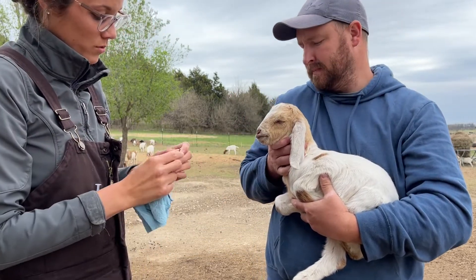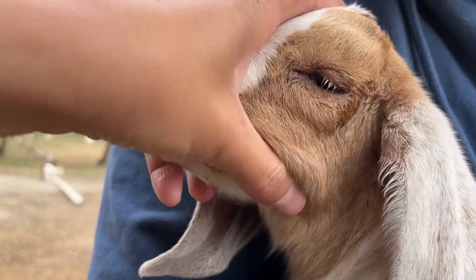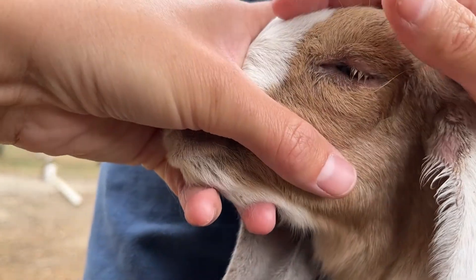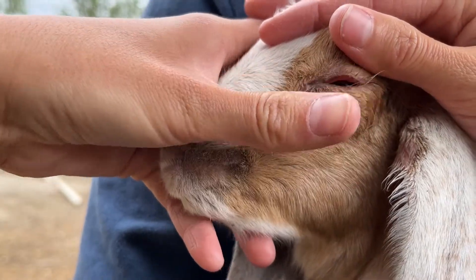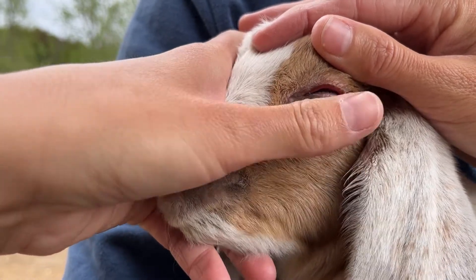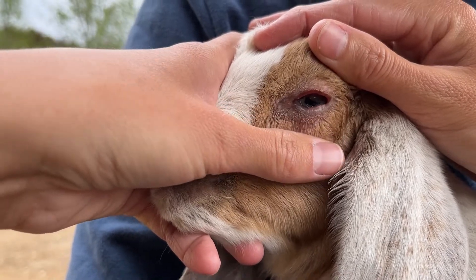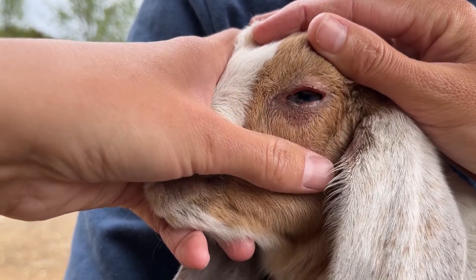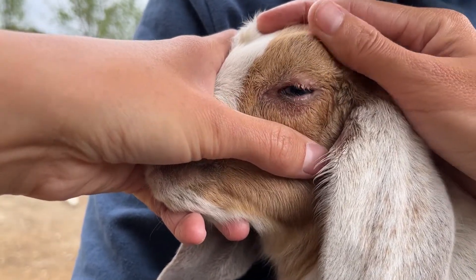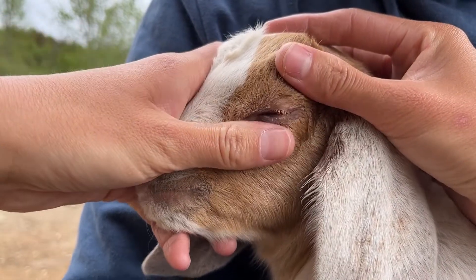We'll be careful about breeding this goat again. I'm going to wipe this up a little bit so you can see, and as we roll her eyelid under you can see — there it popped out. To train her eye to roll out instead of in, we're going to apply wound clips so that it doesn't scratch her cornea and cause irritation, cloudiness, and the watering, which can also lead to blindness.